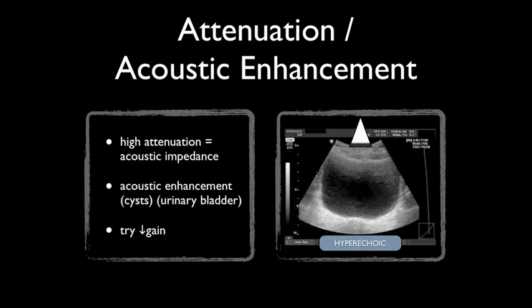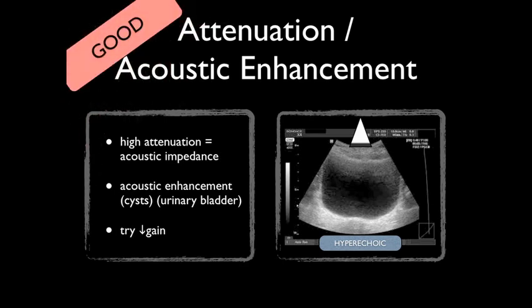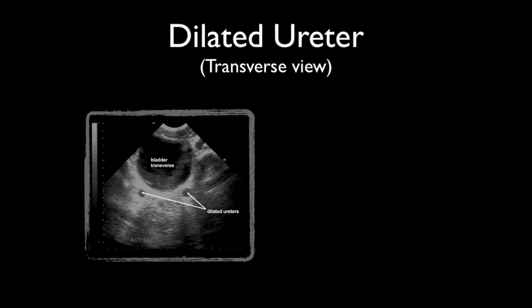Acoustic enhancement is often used to differentiate cysts, which are lower attenuation structures and thus form acoustic enhancement, from cystic tumors and abscesses that have higher attenuation. A normal urinary bladder should display acoustic enhancement. Here's an example of dilated urinary ureters seen below the urinary bladder in the transverse view. For the most part, ureters are difficult to find because their view is usually obstructed by bowel.